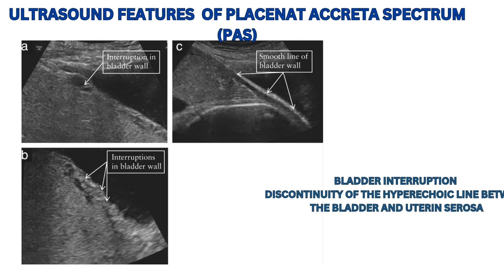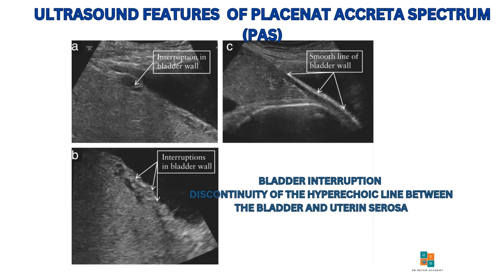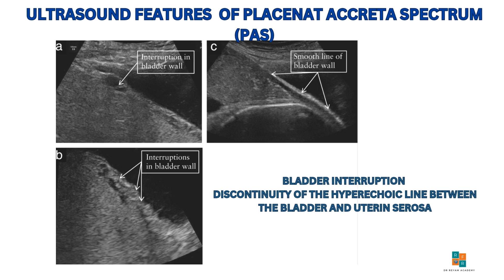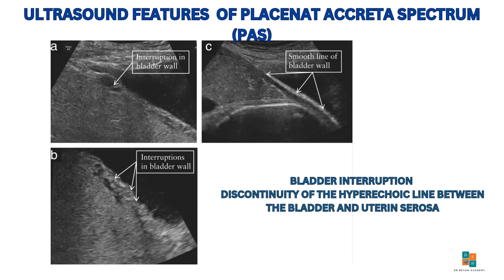Regarding the bladder sign, here we can observe interruption of the bladder wall. We can see an irregularity in the normal hyperechoic line. In these images, we can clearly see the loss of the normal smooth white hyperechoic line of the bladder wall interface.